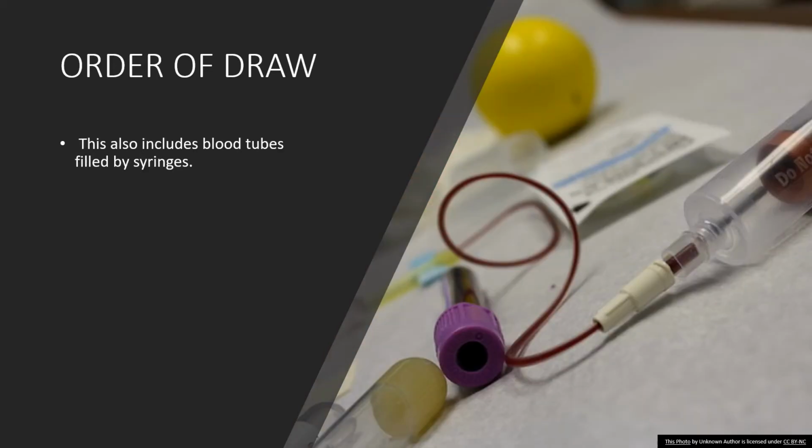So in moving from properly IDing your patient, which is something we will go through over and over and over again, the proper way to ID your patient, ID yourself, and perform your medical interview, which would include whether your patient is fasting or not. So we'll be going over that in lab over and over again, okay?